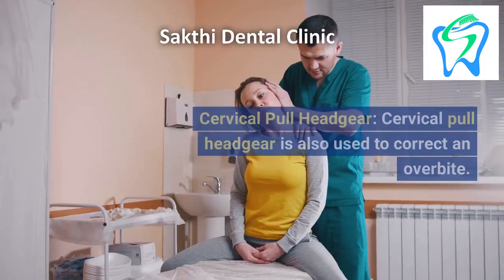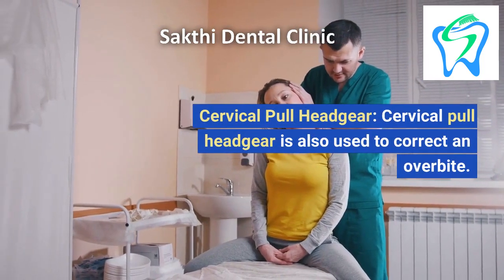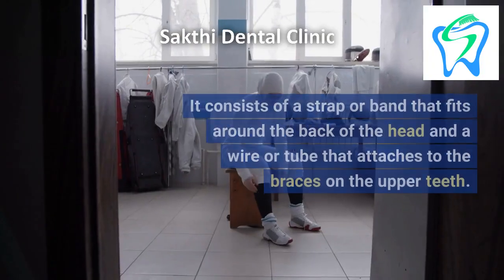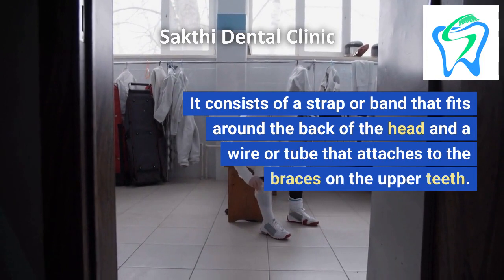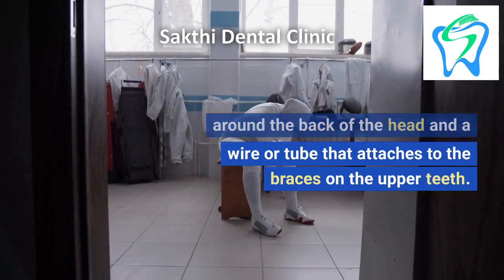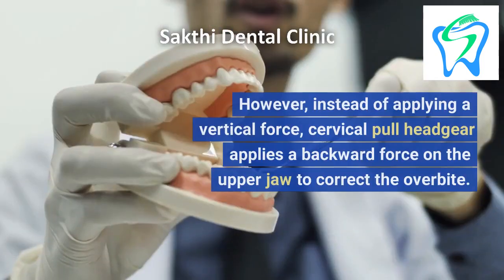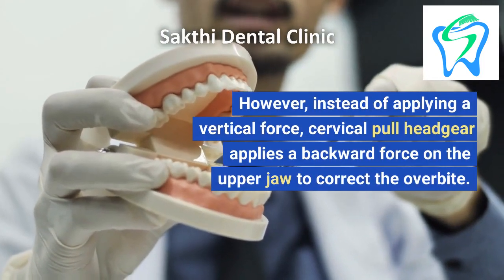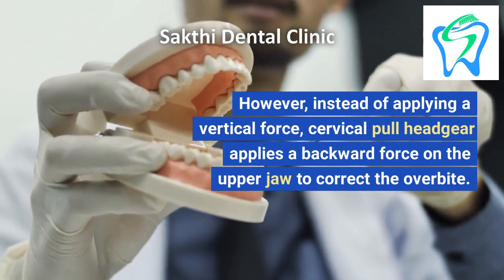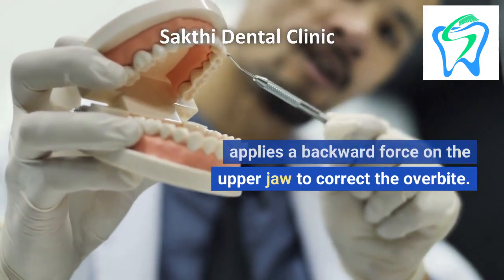2. Cervical Pull Headgear. Cervical pull headgear is also used to correct an overbite. It consists of a strap or band that fits around the back of the head and a wire or tube that attaches to the braces on the upper teeth. However, instead of applying a vertical force, cervical pull headgear applies a backward force on the upper jaw to correct the overbite.